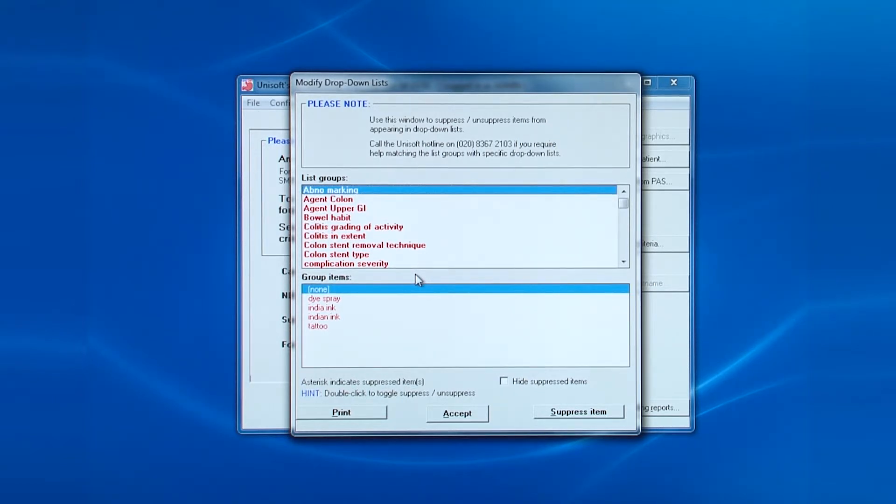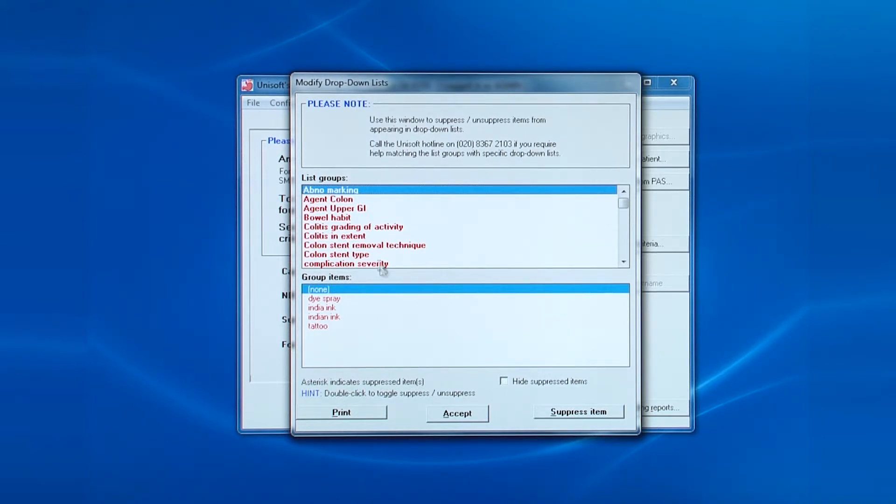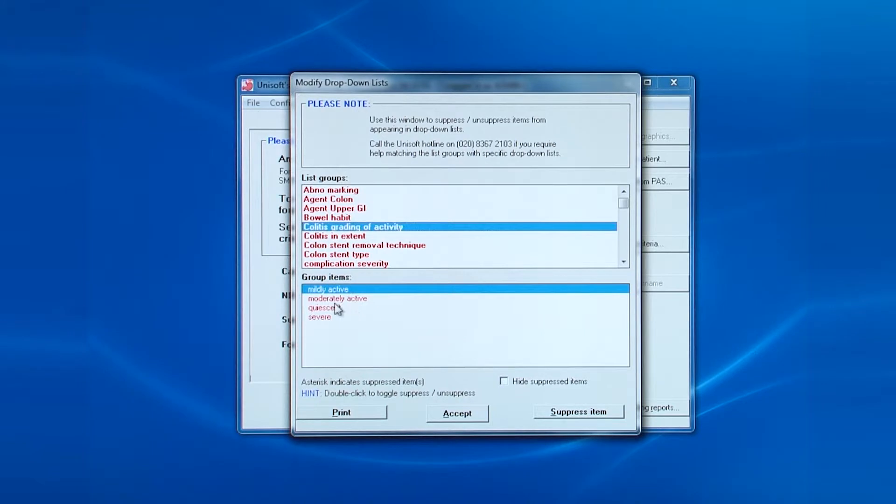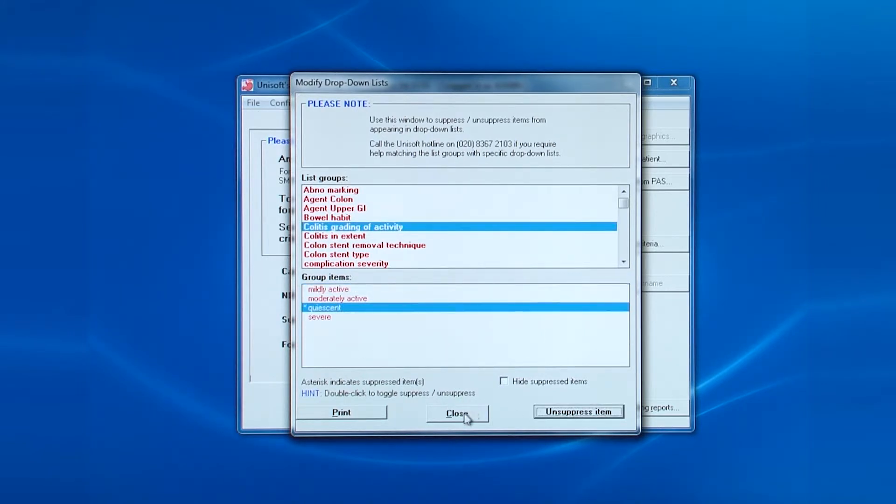In the top half of the screen, you choose the prompt that appears beside the drop-down box and the entries appear in the lower half. You can suppress and unsuppress entries by double-clicking on them.